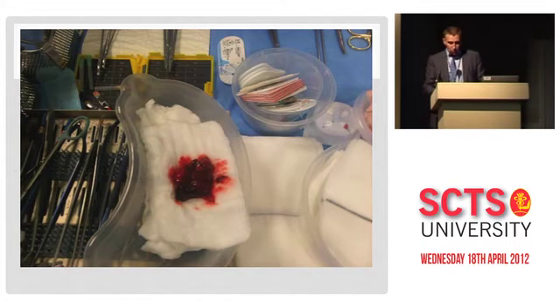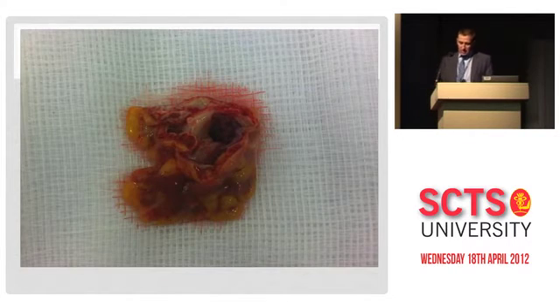Obviously, I hope we would all look at the left atrial appendage in any kind of cardiac surgery, but my exhortation would be, when you do a TOE, always document the left atrial appendage, record a loop, and make sure you document whether there was any thrombus there. You can see that's actually thrombus within the left atrial appendage. I don't know how clear that is. You see the opening of the left atrial appendage with some thrombus towards the tip.